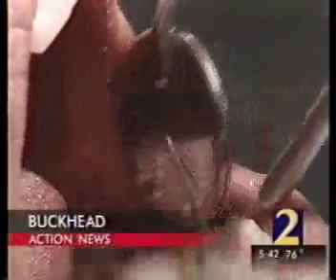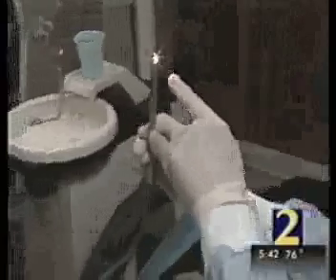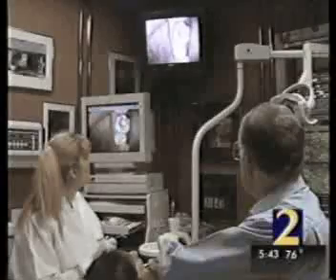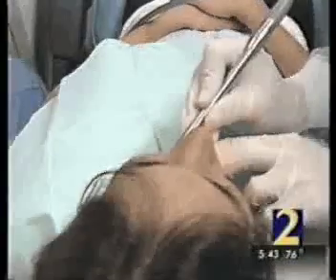You see fillings that look pretty darn good. Commonly, dentists have used a small mirror to look at your teeth. But now, this is an intraoral camera — a little camera with a bright light that will illuminate the teeth and trans-luminate them. The camera magnifies the tooth 20 times, allowing detection of tiny cracks, often associated with old fillings.